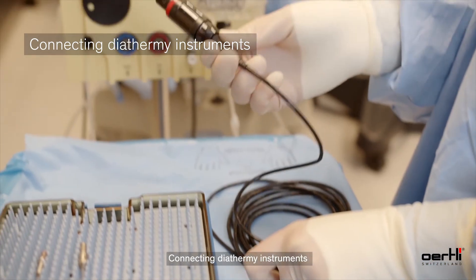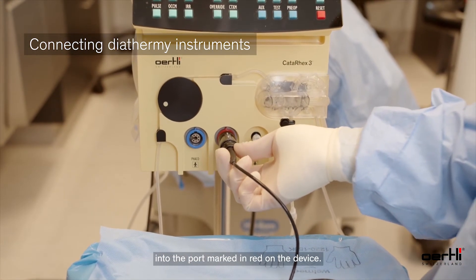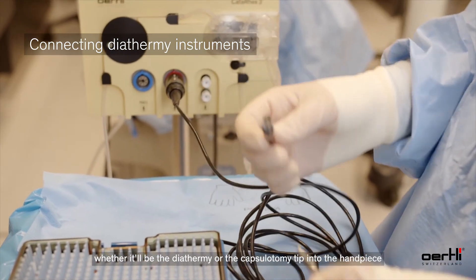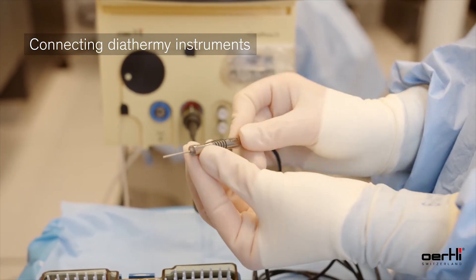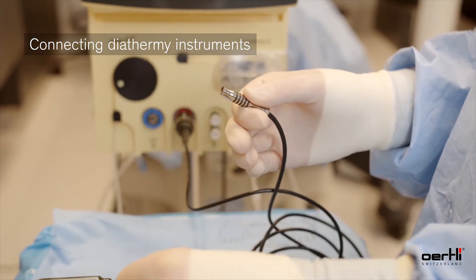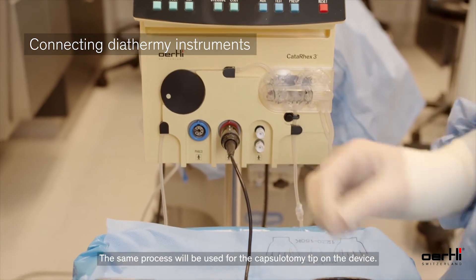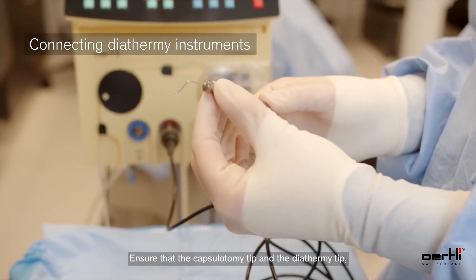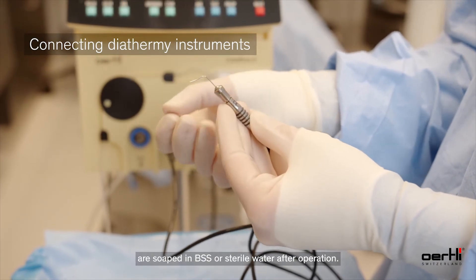For connecting diathermy instruments, insert the plug marked in red of the diathermy handpiece into the port marked in red on the device. Insert the tip — whether it be the diathermy or the capsulotomy tip — into the handpiece; both tips lock into place the same way. Make sure they are locked into position before proceeding. Ensure that the capsulotomy tip and the diathermy tip are soaked in BSS or sterile water after operation.